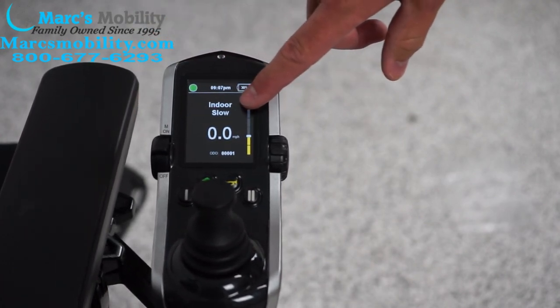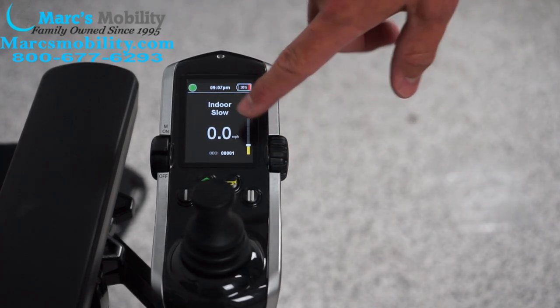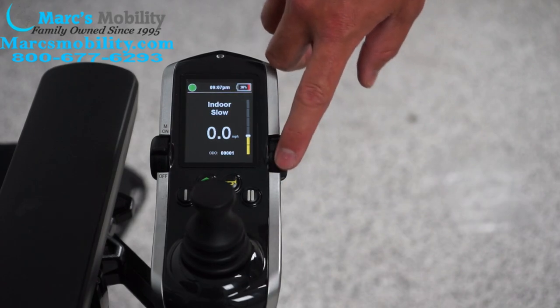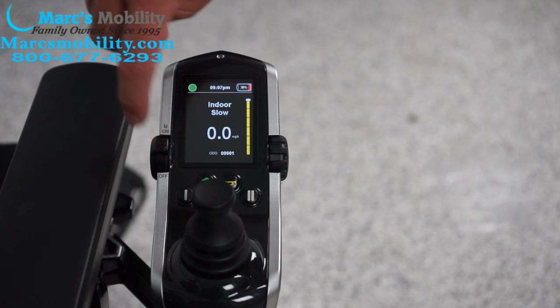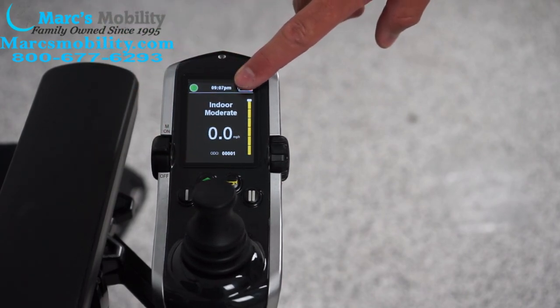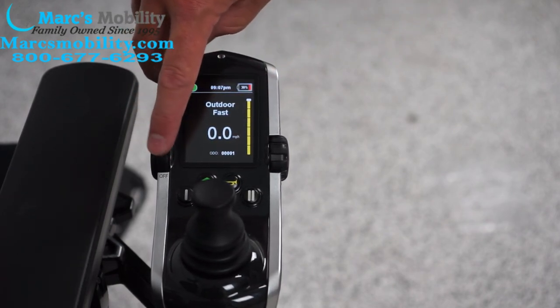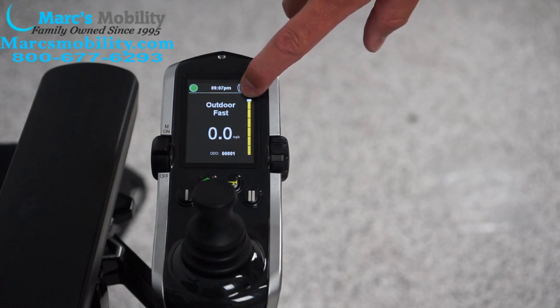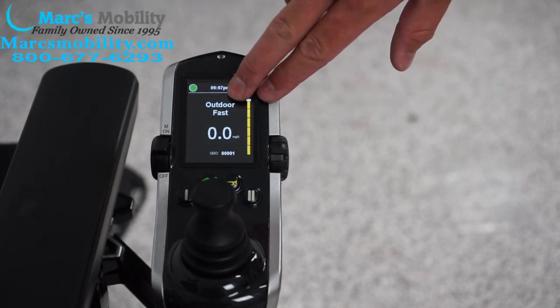You have indoor slow, which is your slowest setting — if you had the knob all the way down on indoor slow, the chair would barely move. Push the lever forward again and you go to indoor moderate. Push it forward again for outdoor moderate. Push it forward again and it says outdoor fast. Those are the four profile functions.